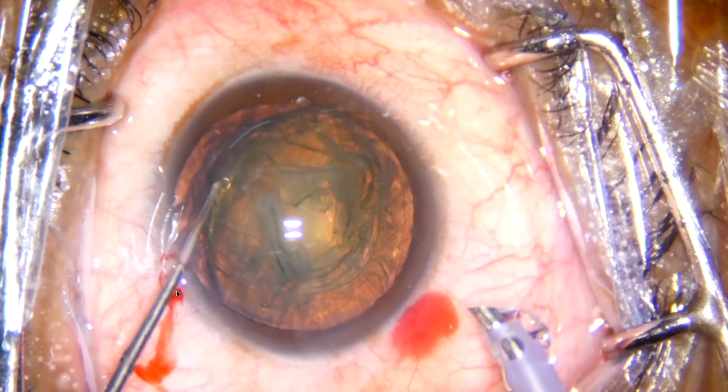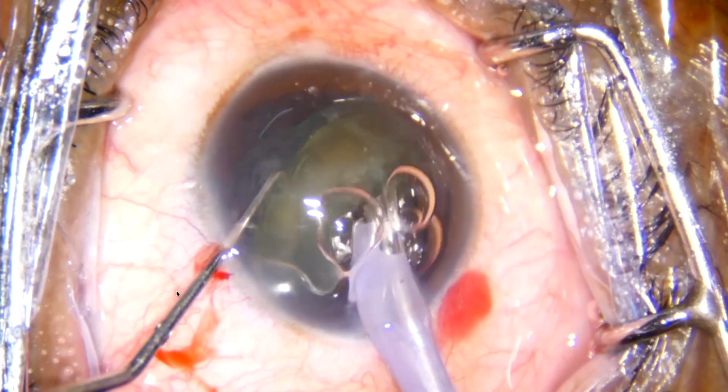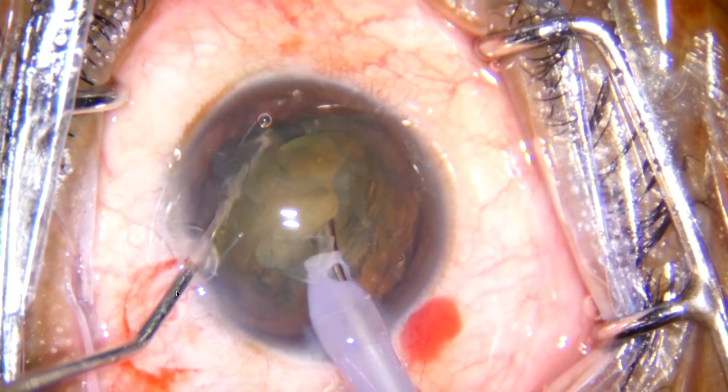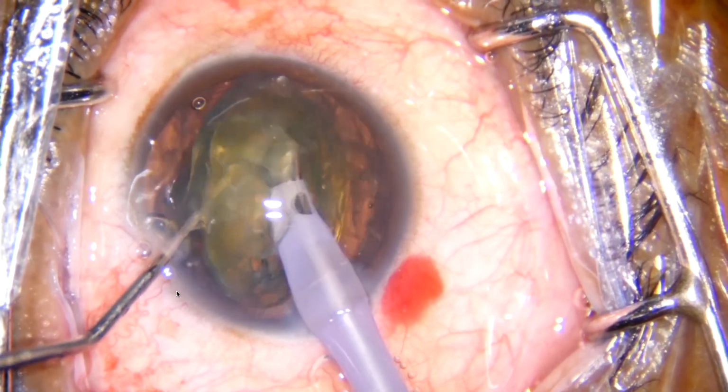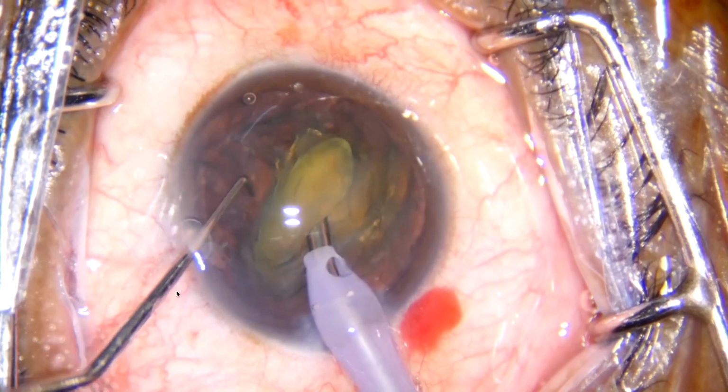So you go behind the nucleus. This is very far away from the endothelium. Don't worry, nothing will happen. Hold in the center and chop from behind, so it will easily chop. The problem of bringing it out of the bag is not there in this.